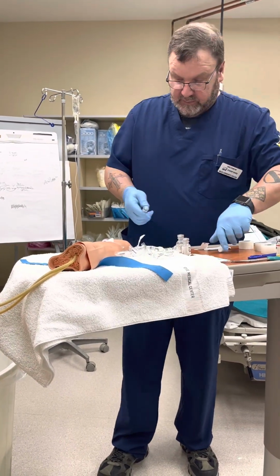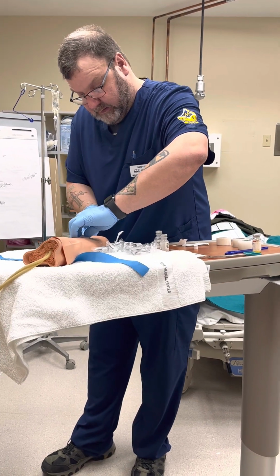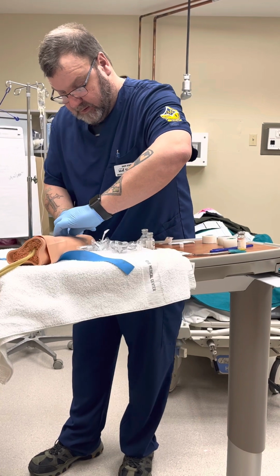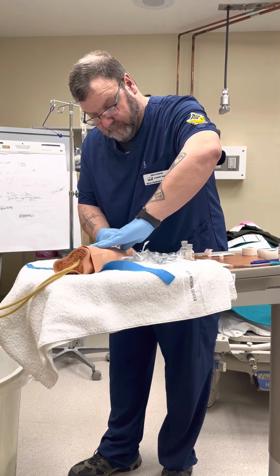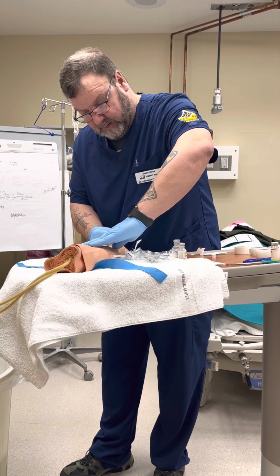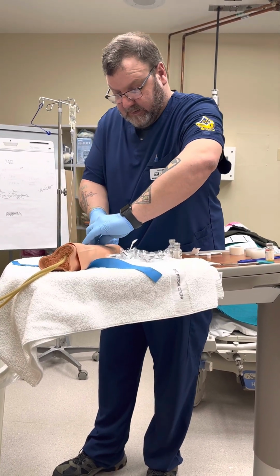I'm then going to take my saline, connect that to my port, and I'm now going to slowly flush and assess while doing so the 5 mLs of flush. So that is good to go.